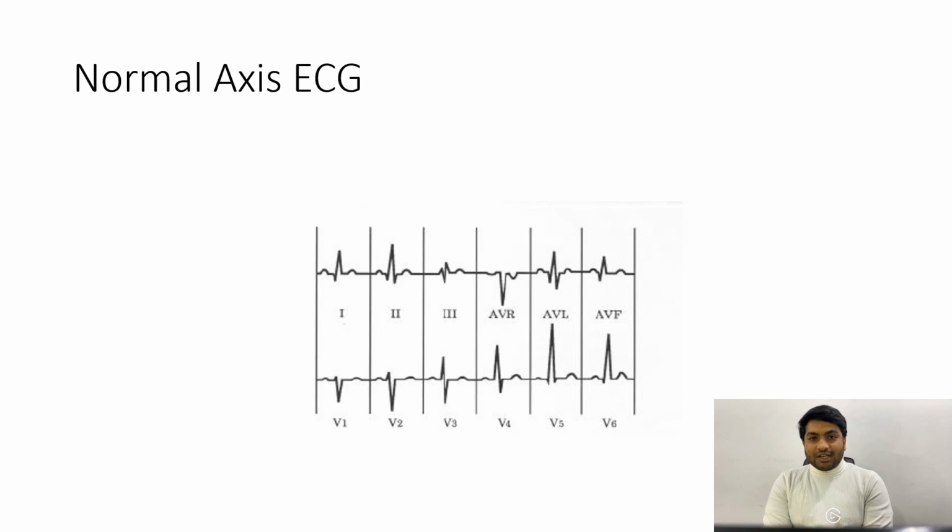This is Dr. Shiraz and today we are going to talk about axis and why it is so important. So first of all, I would like to talk about what axis is.